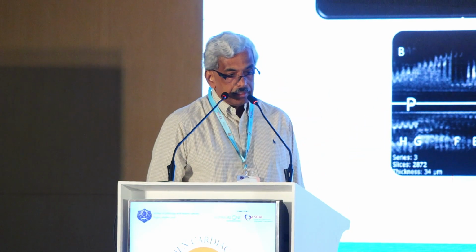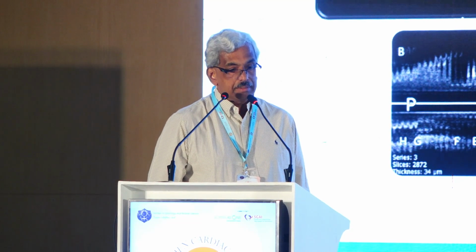In diameter, here this is 4.3. So clearly we need a 3.5 stent plus in the circumflex. We need a 4.5 maybe in the left main. So that's the plan in my head as I start doing this case.